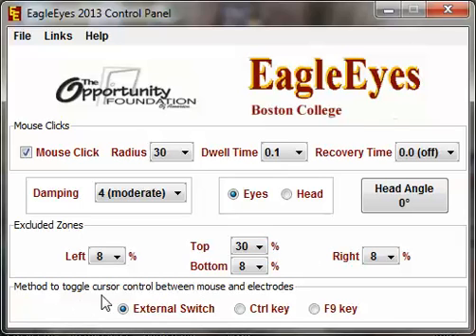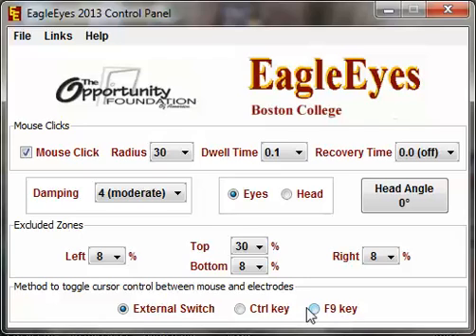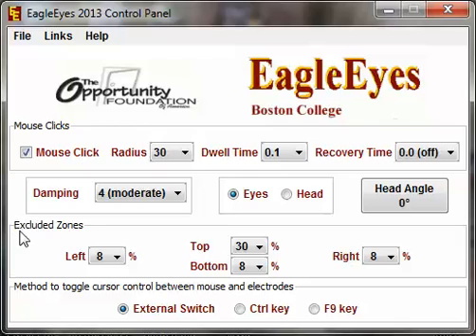Below we have the method to toggle cursor control between mouse and electrodes. If you prefer the external switch on the console, you can use that, or you can switch to a control key, F9, or on an Apple the command key — whatever your preference for switching between mouse control and EagleEyes control. There is also a tip video that goes over excluded zones in detail if you'd like to learn how to configure those better.